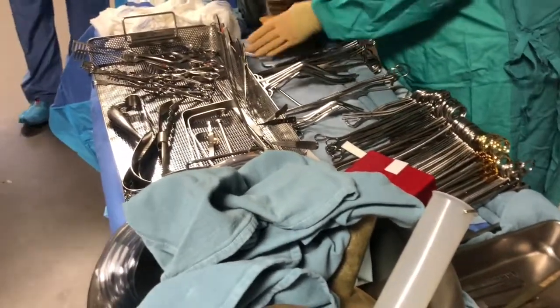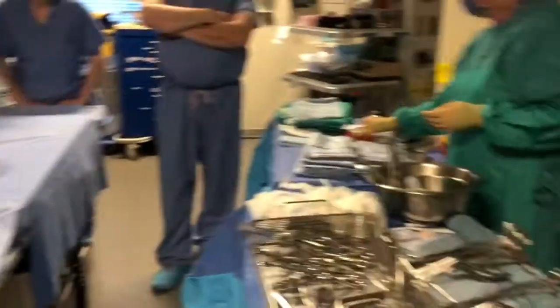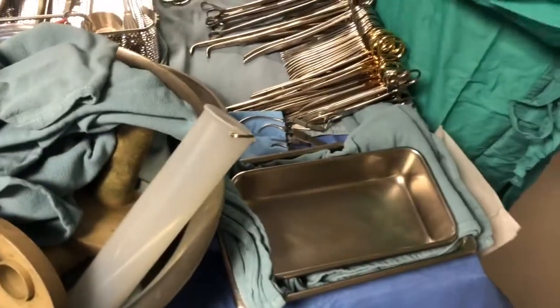So now what you're going to do is flip the page over, and we're going to count everything. You're going to start with scalpels, which should be right at the front.